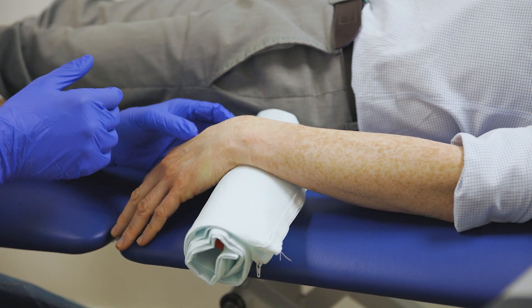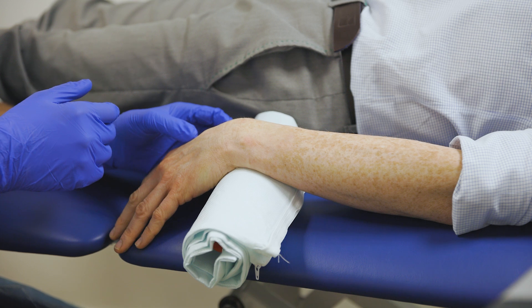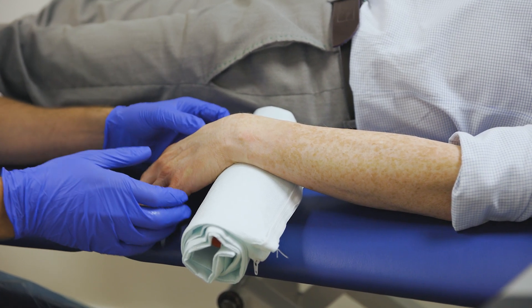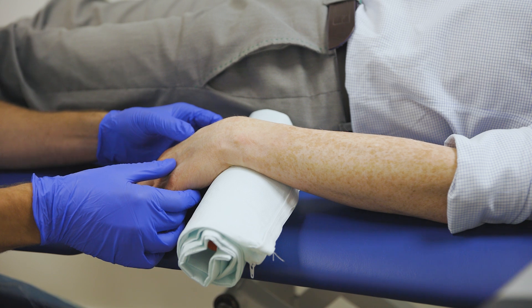I generally would inject a couple of mils of 1% lidocaine and probably 0.5 mils of depomedrone, but obviously it depends exactly what I'm trying to achieve.